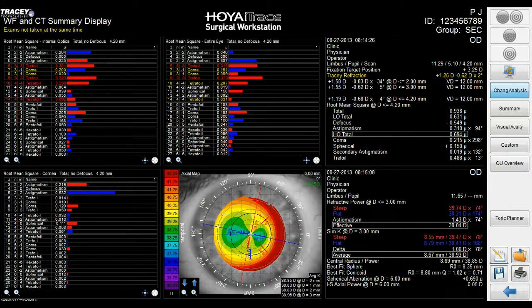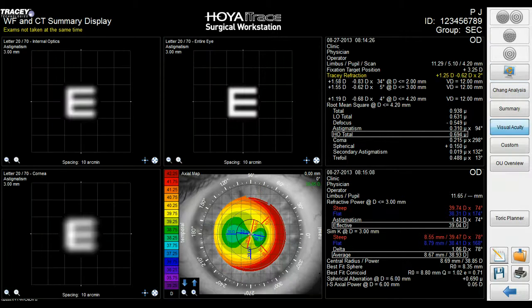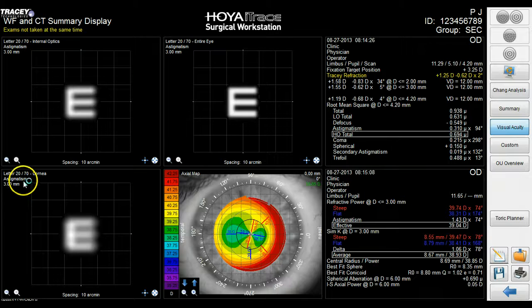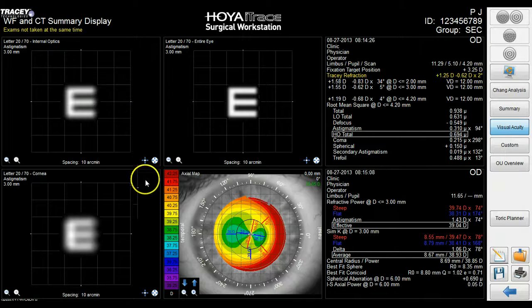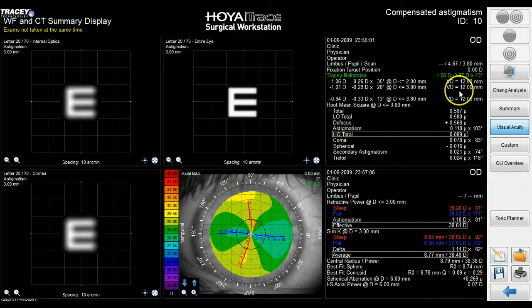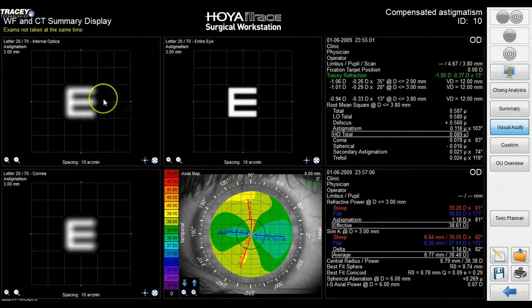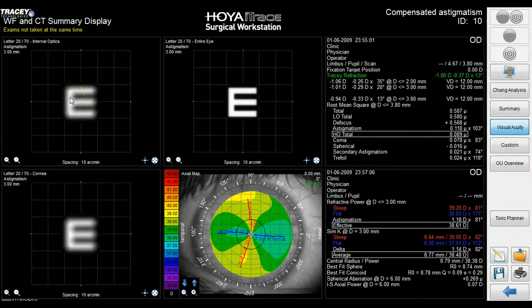In this next case, however, the patient's cornea is free of significant higher-order aberrations, so we can proceed to the next step. Before we move on, if a toric IOL is being considered, we can use the wavefront and CT summary display to be sure of the source of the astigmatism error. We can quickly see if the astigmatism is corneal, lenticular, or both. If the astigmatism is all lenticular, a toric lens is not necessary. Or, perhaps a patient with no astigmatism in their manifest has corneal and lenticular astigmatism that offset each other, as in this case. Once the crystalline lens is removed, the patient may require a toric correction that was never required in the past.